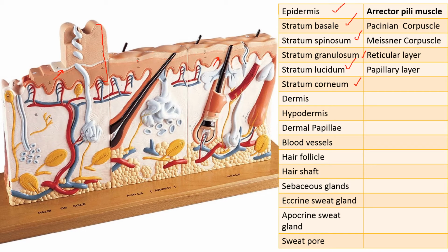Of course you can. It looks very similar to what we saw on the last slide. So the dermis basically goes from the basal surface of the stratum basale through all of this light pink material here down to the hypodermis. Okay, there is your dermis. You have the dermal papillae here. Again, they look like these little hills, right? And you see the capillary loops in there. That's the papillary layer of the dermis.